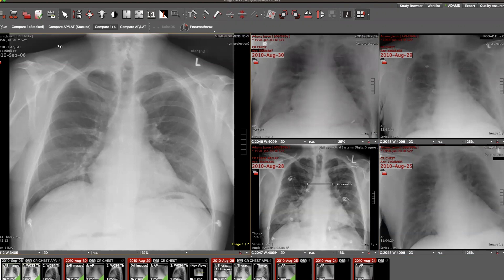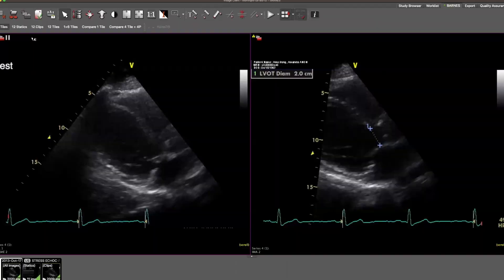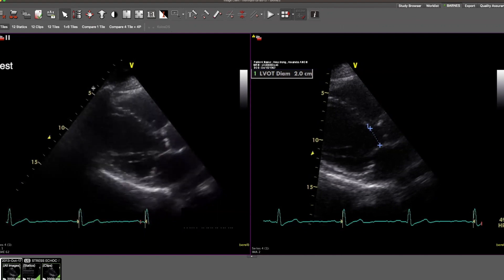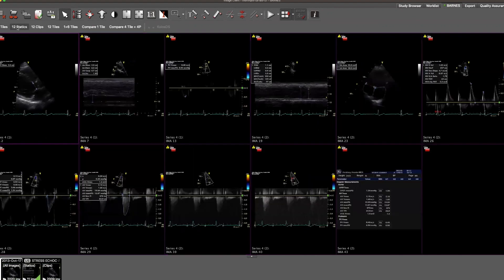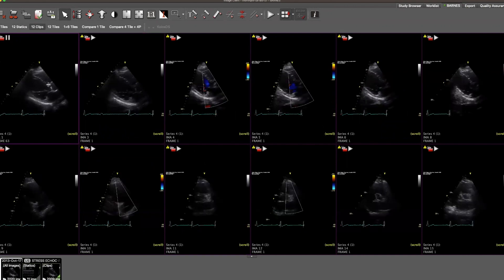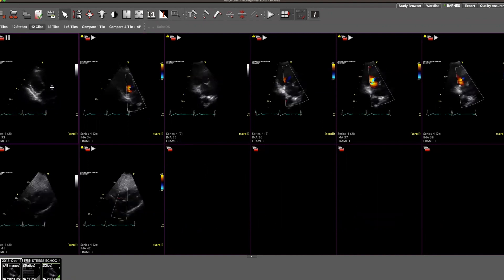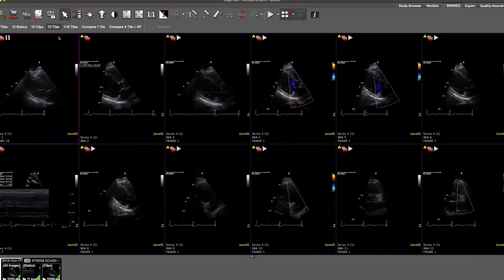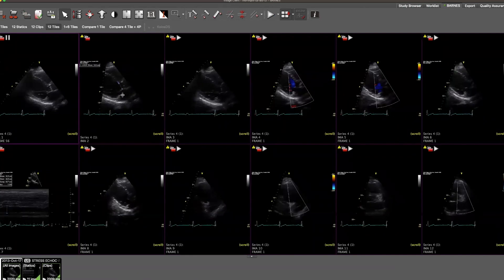Now we'll move on to the next study from our work list. Here we have an ultrasound in a two-tile layout, side by side, right and left display. If I step to another layout, I can look at just the static images by themselves. A different layout will display all of the clips in a tiled format, where I roll my mouse wheel to view the additional clips on the next page. Finally, I have a tiled example where all of the images are displayed.